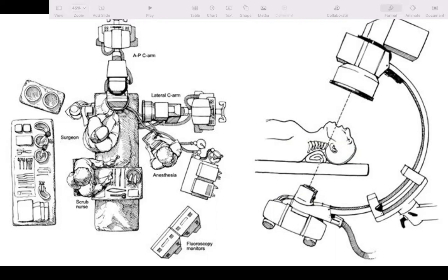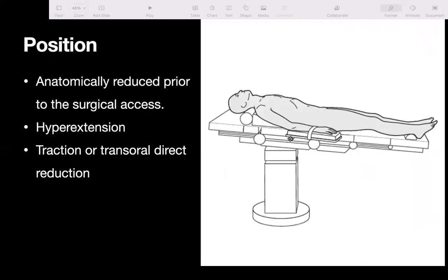The surgeon stands at the axilla or on the right side if right-handed. The neck should be hyperextended, and the chest should not interfere with the trajectory. The prerequisite for this fixation is that the odontoid should be anatomically reduced.